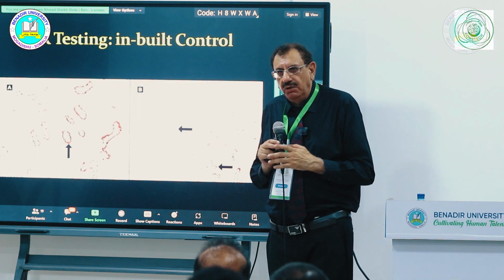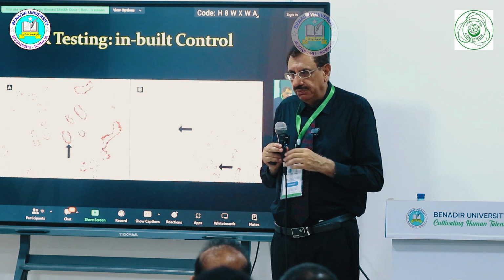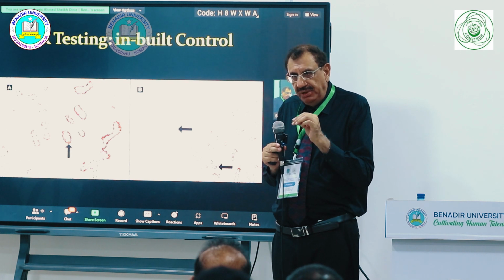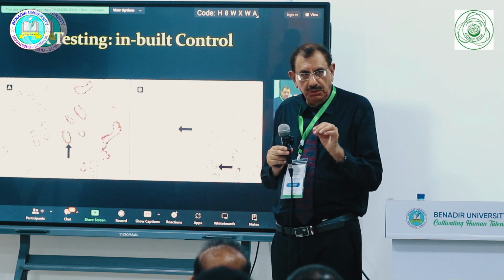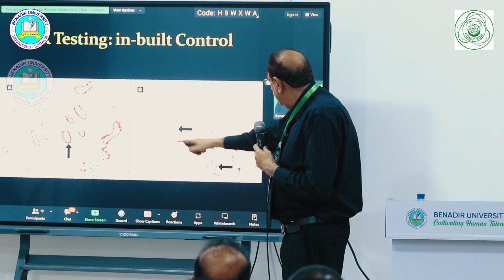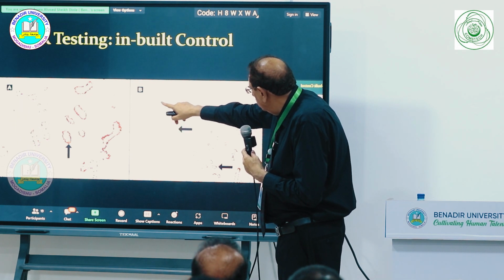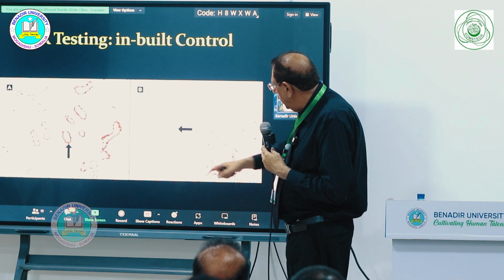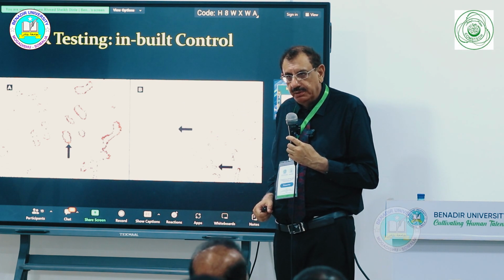Now, always when immunohistochemistry is done for estrogen receptor, a built-in control will be most ideal, because then you will know that your antibody is working, right? For example, you see, this is a carcinoma, a very well differentiated carcinoma, forming tubules and very strong staining with the antibody against estrogen receptor, right?